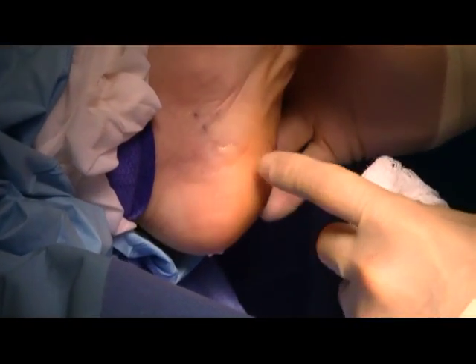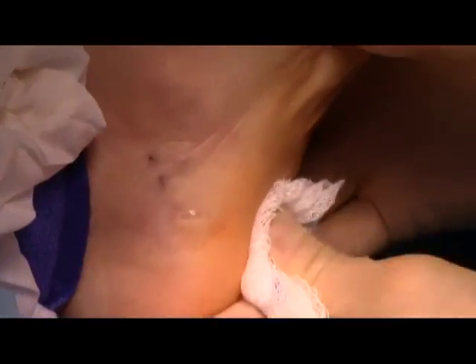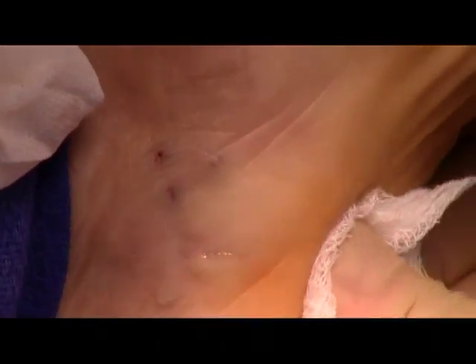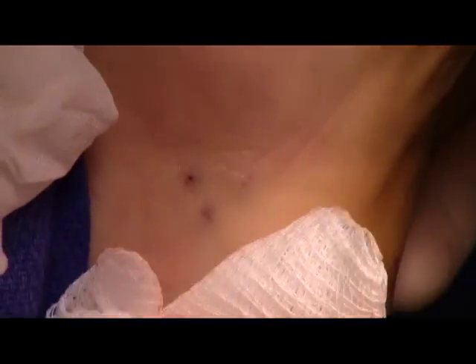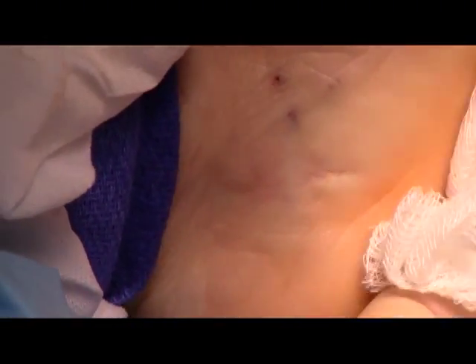This is the extent of the incision. It's a one centimeter incision, as you can see — pretty small — and we've been able to transect the ligament that was causing the heel pain. After about a week, we'll have her back in her sneakers.